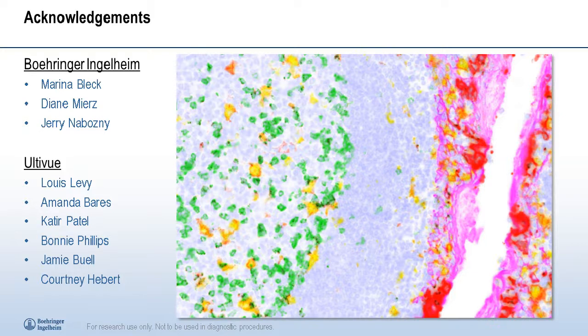Question here, they say, is it biotinylated tyramide signal amplification, and how much BTR or tyramide signal may or may not interfere with other antibodies? I guess here they're going back to maybe your original discussion. Yes. So our workhorse in the lab is not using the biotinylated tyramide, but just the tyramide fluors. That extra level of amplification hasn't been necessary for our applications. So I can't really comment on biotinylated tyramide signal amplification. Great, thank you.